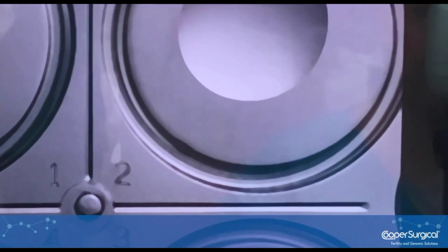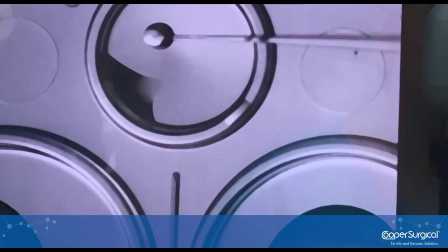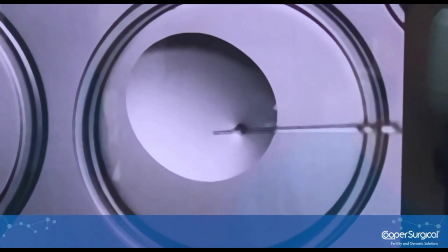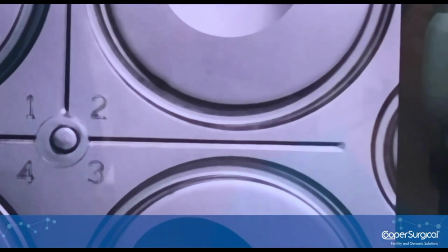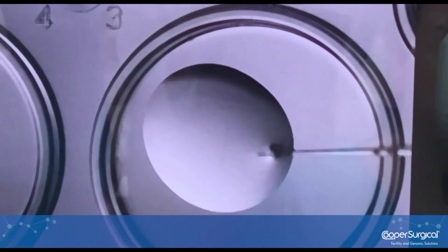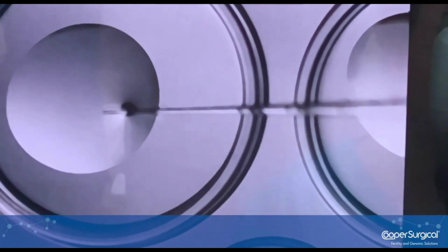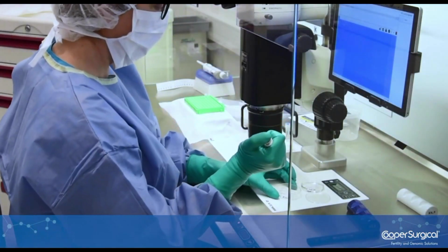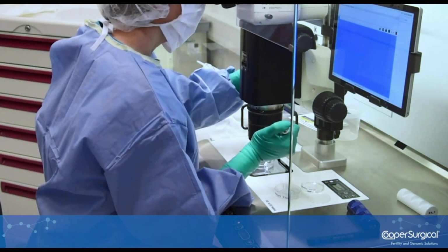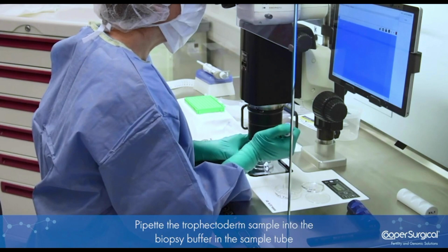And then flush it out. We will expel again the excess medium, and take fresh medium from the next drop. In this way, we will continue to move the sample, to wash the sample through these 4 drops. Try to avoid taking oil from the biopsy dish through the washing steps, because oil might interfere with the amplification of the DNA. So now we have the sample in the pipette with 0.5 microliter of buffer.